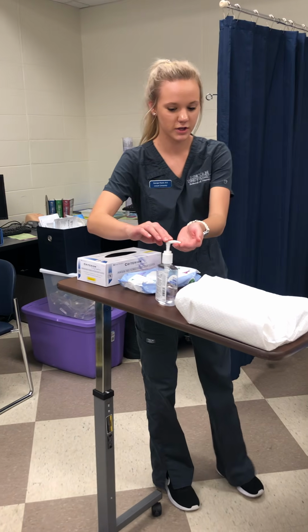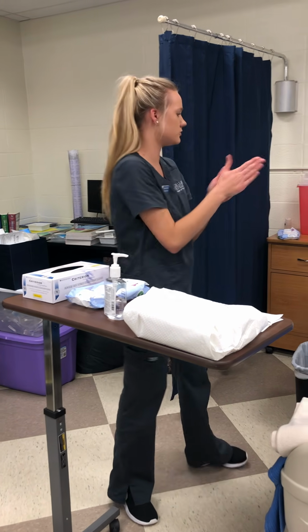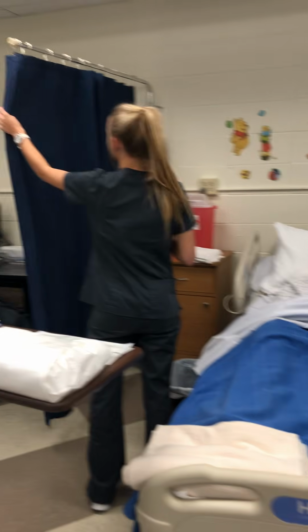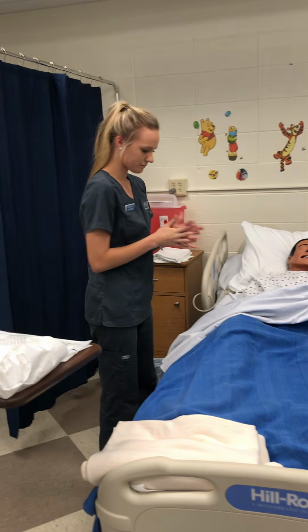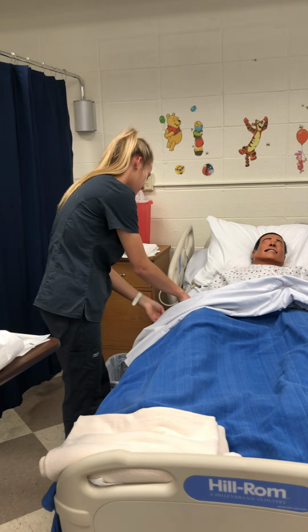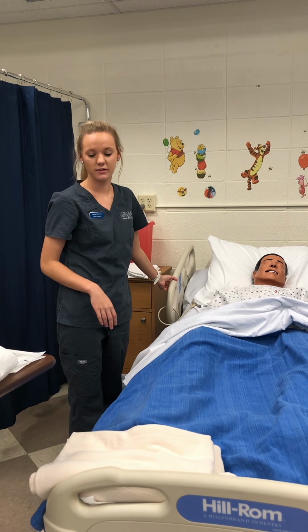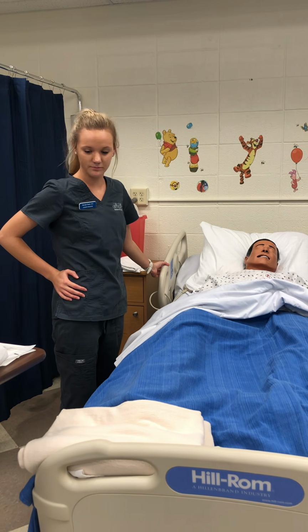Hi, Mr. Jones. My name is Georgia. I'm going to be your nursing student today. How are you doing? Good. I pull the curtain to provide for privacy. Mr. Jones, can you tell me your name and date of birth? Perfect. I'm going to raise the bed to my waist level.